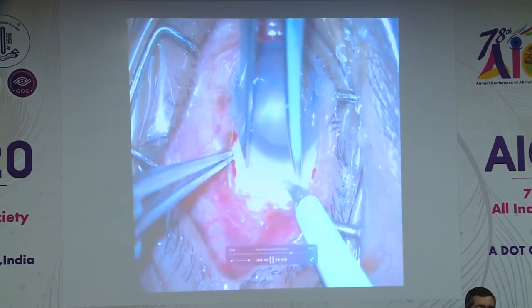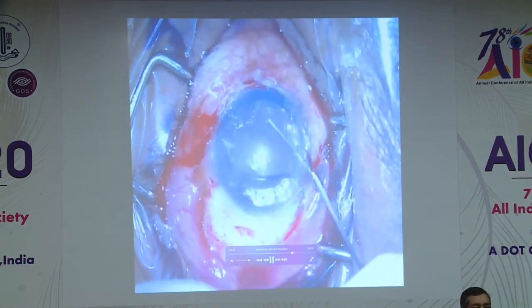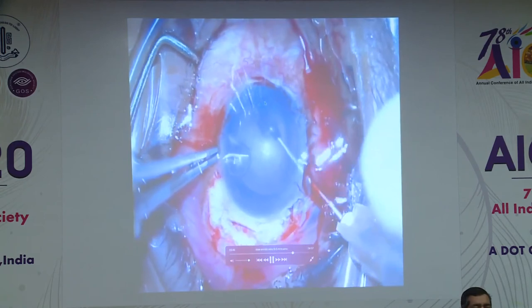This is a third case who had come to us with a history of corneal trauma, and I could see a glass foreign body lying in this patient.